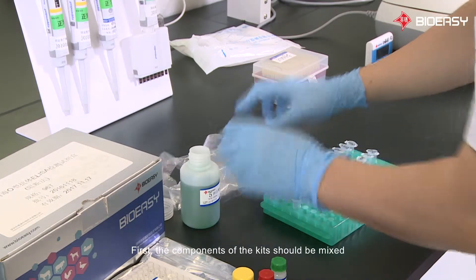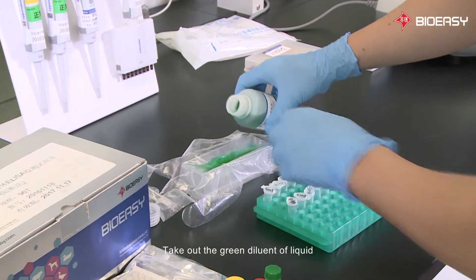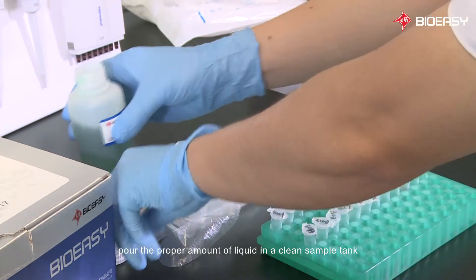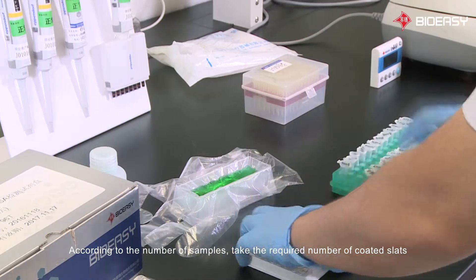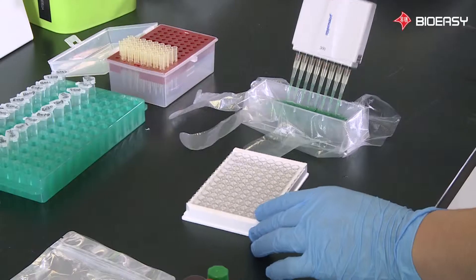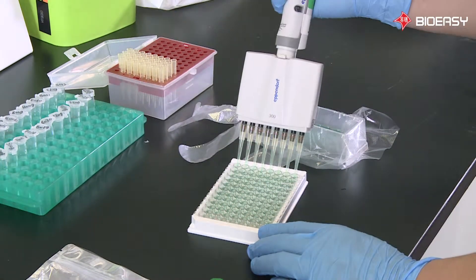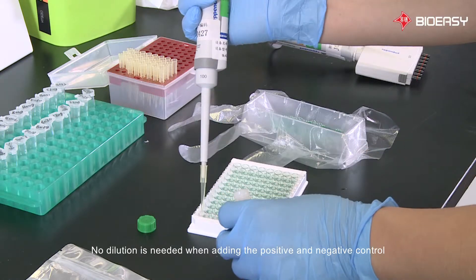First, the components of the kit should be mixed. Take out the green diluent liquid and pour the proper amount into a clean sample tank according to the number of samples. Take the required number of coated plates and add 50 microliters to the coated plate. No dilution is needed when adding the positive and negative controls.